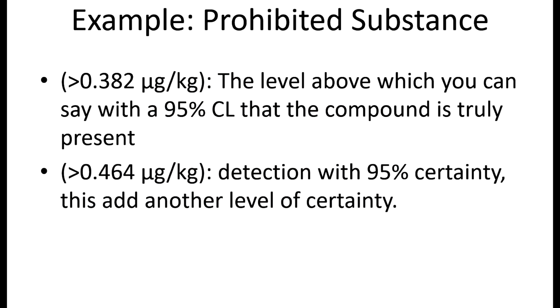So in the case of prohibited compounds, it is very important, especially in the case of veterinary drugs. It is not always required to calculate CC alpha and CC beta, but it is required by this validation guideline.